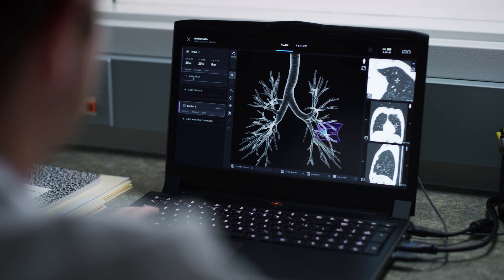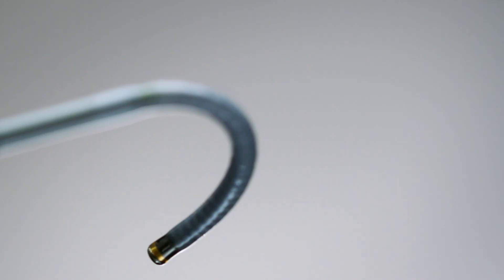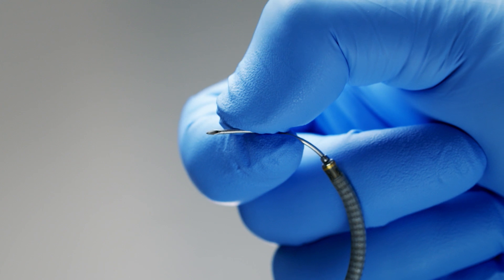With ION's PlanPoint software and the catheter's ability to articulate 180 degrees in any direction, and our flexision needle, we're able to access all 18 segments of the lung and tumors even outside of the airway.